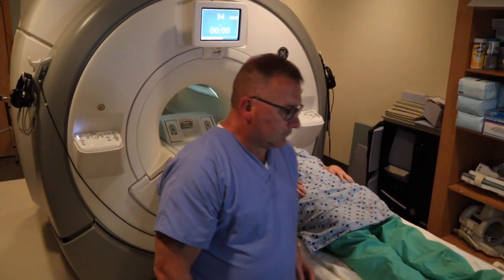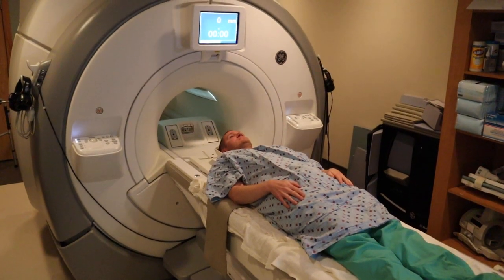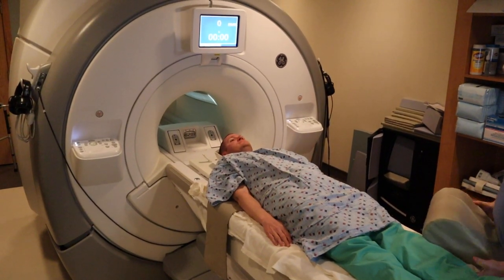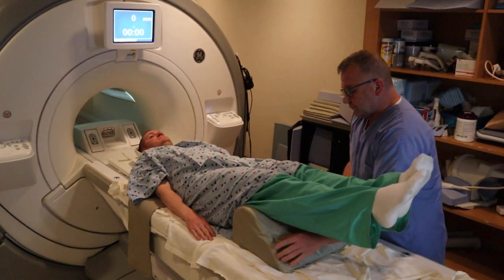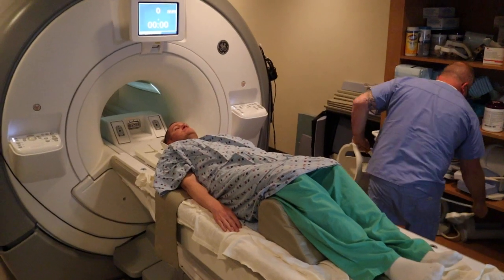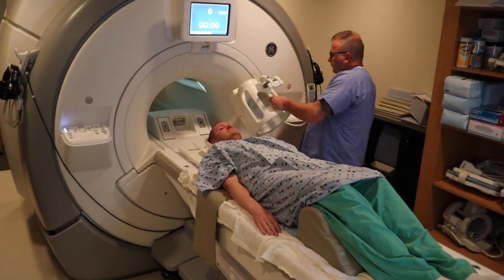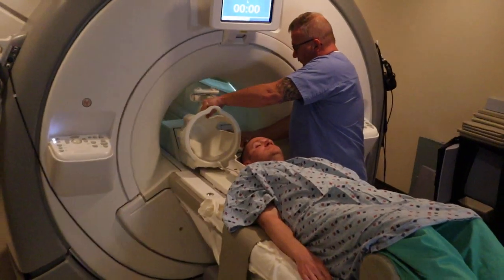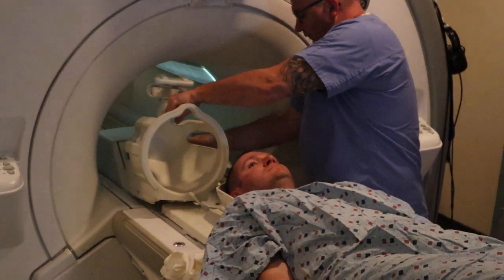The patient is going to be supine on the back, hands down to the side. We're going to make sure the patient is in a gown. The technologist is positioning the legs to make it comfortable on the back. What the technologist has in his hand is the eight-channel brain coil.